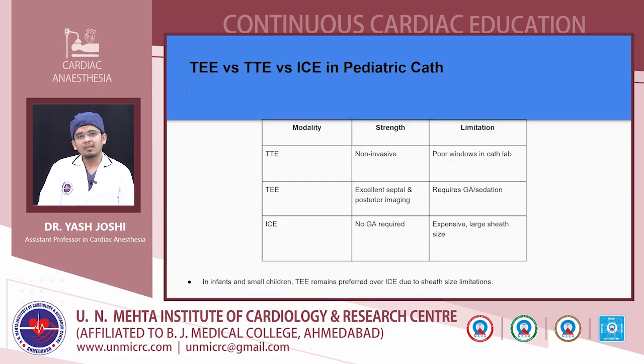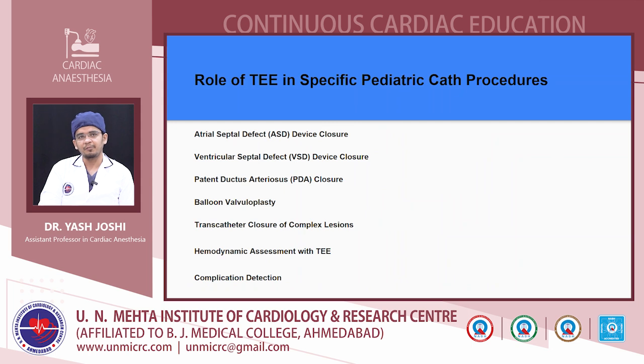Now we compare this TEE with transthoracic echo as well as intracardiac echo. TTE is non-invasive and readily available, but many a times in certain congenital lesions it provides a poor window in the cath lab, whereas TEE provides excellent septal as well as posterior imaging, but it requires sedation as well as general anesthesia. Coming to intracardiac echo, it is expensive and needs a very large sheath, and there is limited vascular access in such small pediatric patients, so it is not that feasible compared with transesophageal echocardiography.